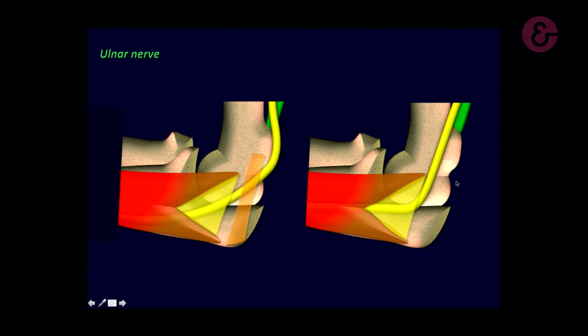On flexion, sometimes there is no retinaculum. It's a normal anatomic variation, or there is a term, the reticulum, allowing the nerve to displace anteriorly. So every surgeon asks you, is there a compression of the ulnar nerve? Is this located in the cubital tunnel? Is the nerve unstable, yes or no, anteriorly?